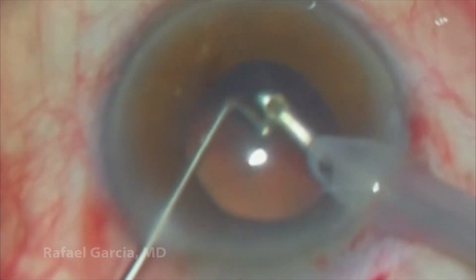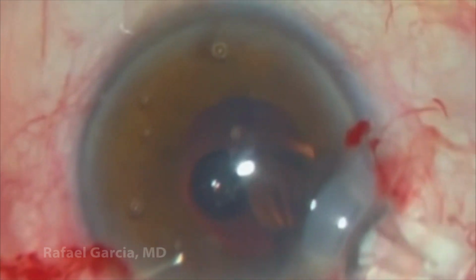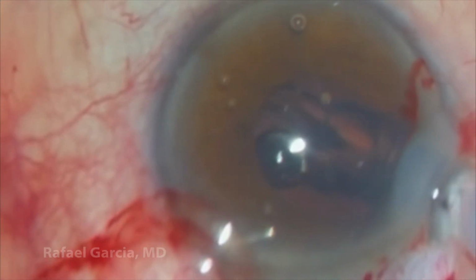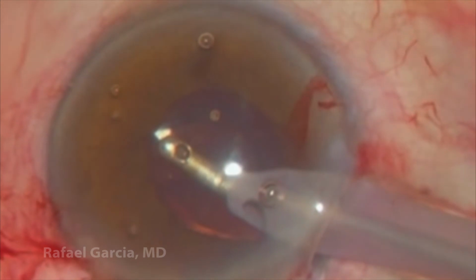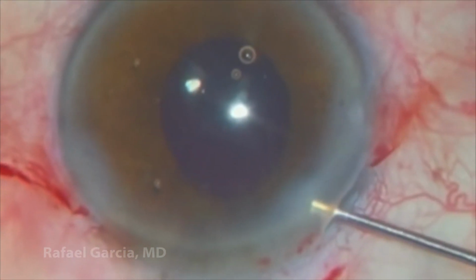Finally, the remaining pieces are aspirated, the capsular bag is filled with viscoelastic, and now comes our single-piece acrylic IOL, sliding right inside the bag. The viscoelastic is now aspirated with the IA probe, the corneal incisions are hydrated, and now this intumescent white cataract surgery is concluded.